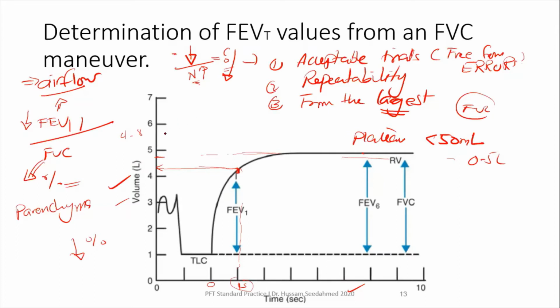And the opposite applies to patients with restrictive lung disease, which affects the parenchyma of the lung. So their FVC is going to drop, and at the same time their FEV1 is going to drop. Here the FEV1 does not drop because of a problem in the airflow, but because of the decrease in the total cross-sectional area, since restrictive lung disease means small lungs.